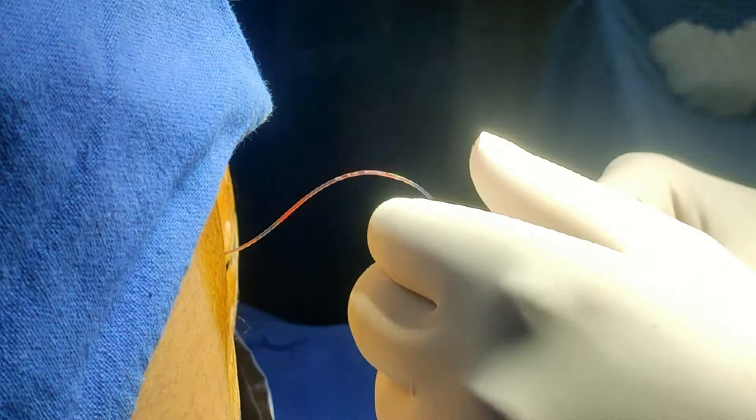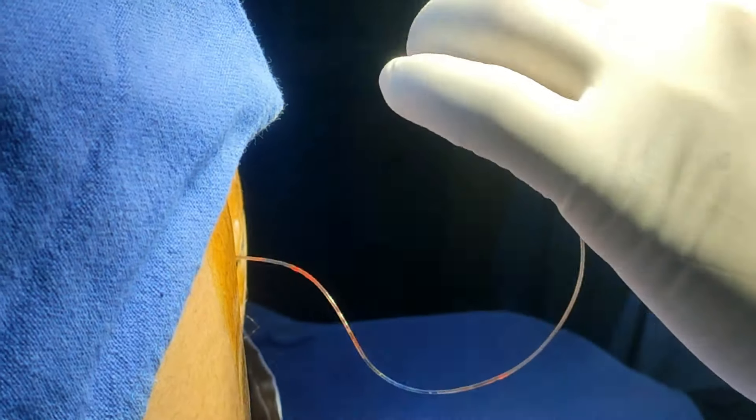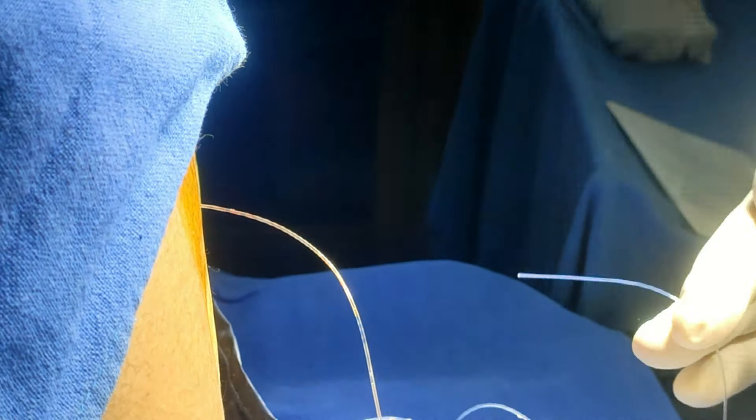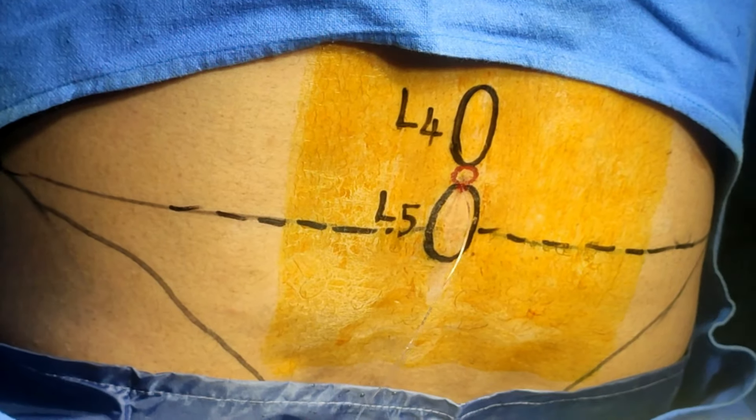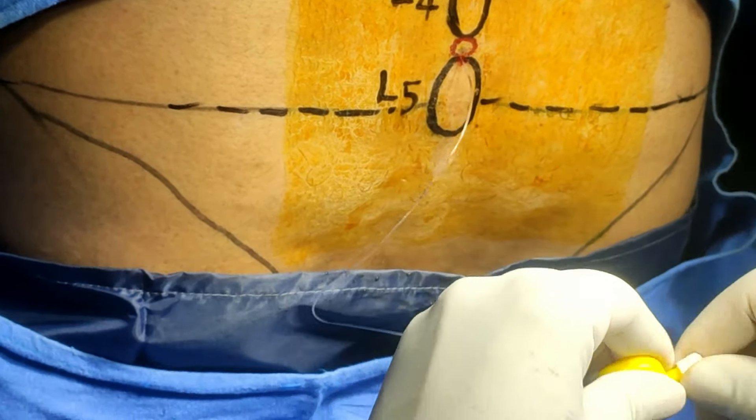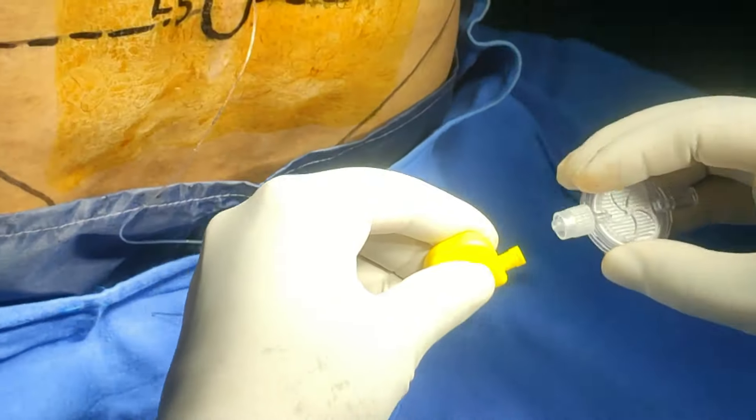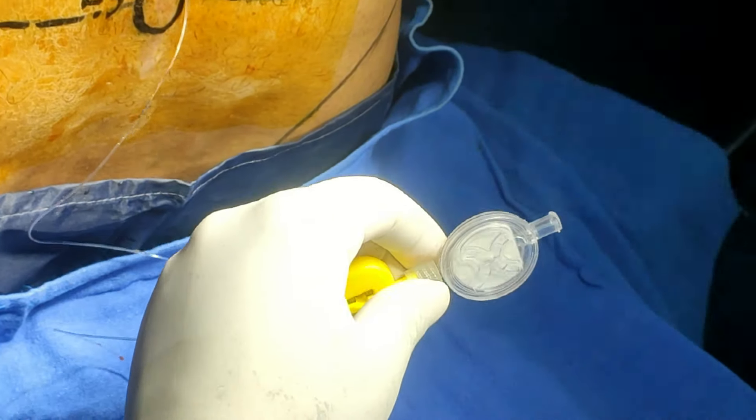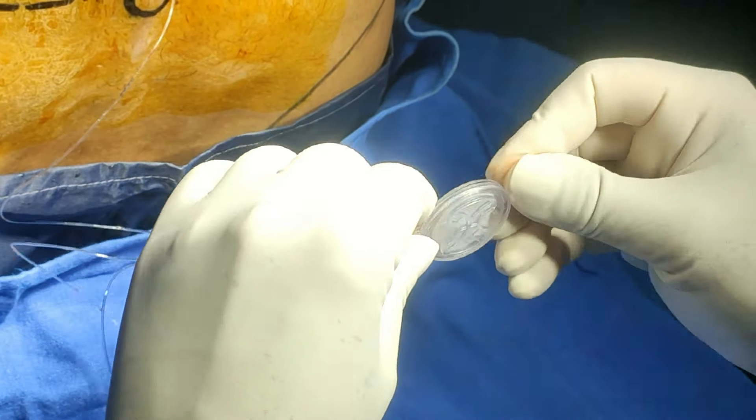Hold it and remove the needle edge. Now you can add the filter and connect the hub here. This is complete.